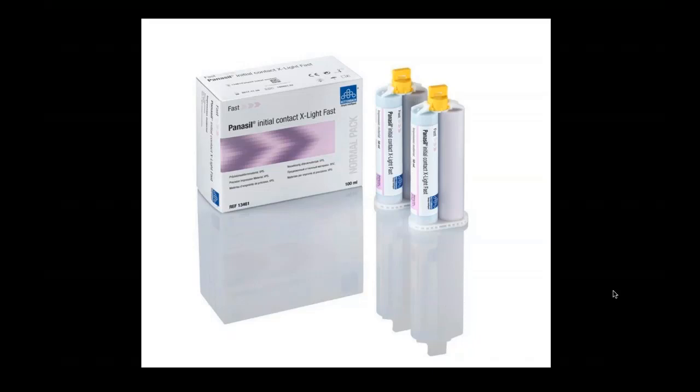Thixotropic talks about the contact surface and how easy it is to remove off of the tooth so that it doesn't get locked on. It's very elastic. So that's what that is all about there.